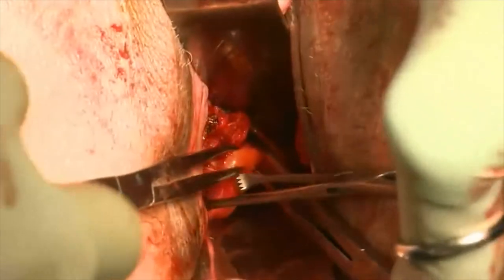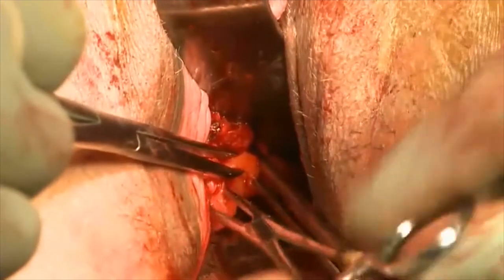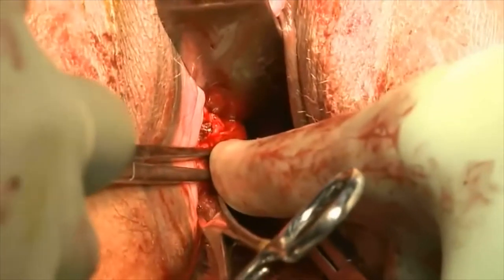As you can see, I have grasped the utero-sacral ligament initially distally, and then with the pointed index finger, I'm showing you the high utero-sacral ligament, which is grasped by the Alice clamp.